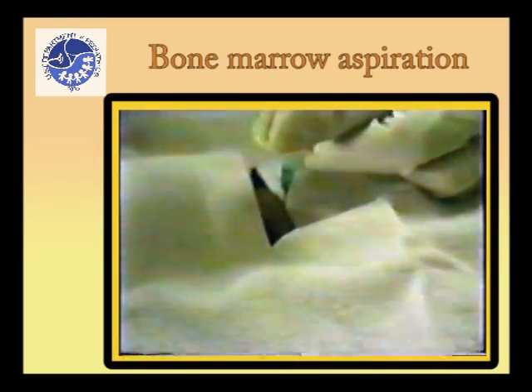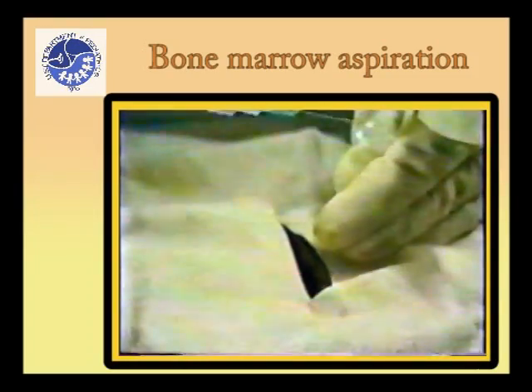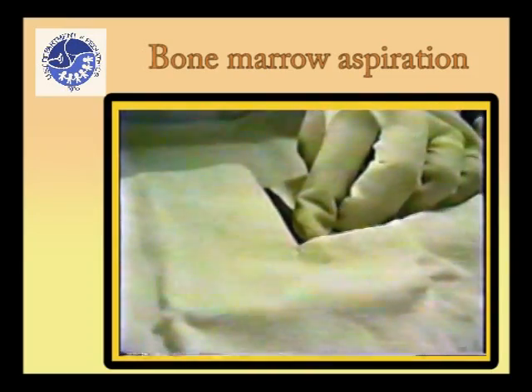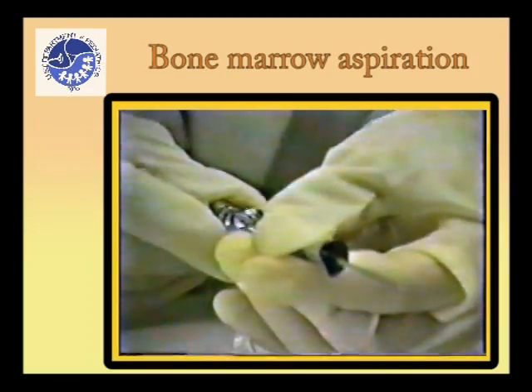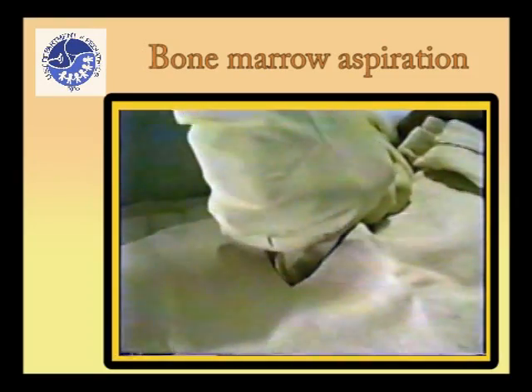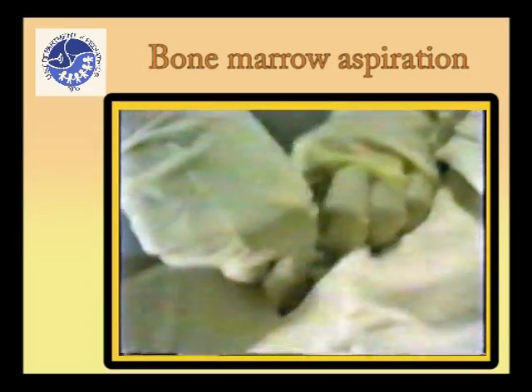Notice the depth to which the needle penetrates before reaching the bone, as this will give a good indication of how deep the bone marrow needle must go. Massage the area gently with sterile gauze before inserting the bone marrow needle to allow spread of the local anesthetic. Insert the bone marrow needle vertically and with a boring and slightly rotating motion, advancing it into the bone until a sudden give is felt as the marrow cavity is entered.